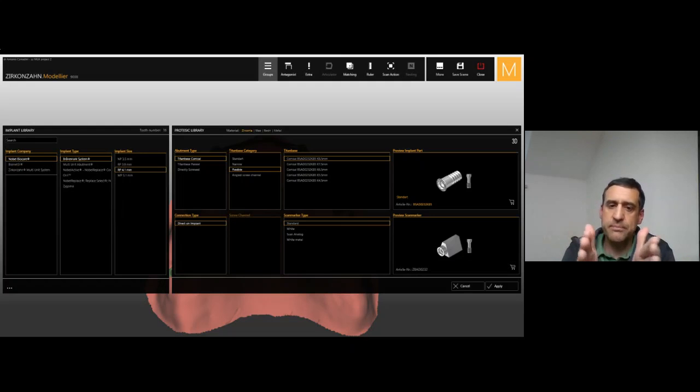So it's really flexible, this T-base, because it comes really large, but you can also cut it at a different level, and directly also in the software. So once you select, for example, 4.5, you know that you have to cut it on the first line here, and the T-base will fit perfectly inside the framework. That's really easy to manage and really flexible for the different frameworks we can have in the lab, high or not so high.